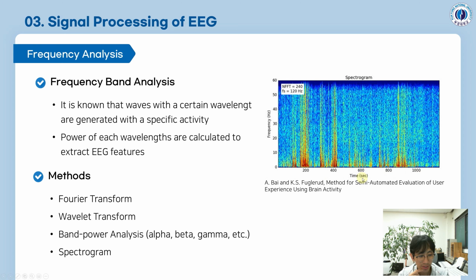Maybe this is seconds, I'm not sure. If this is seconds, then this is going to be 10 minutes from the start. Okay. So this is a very easy approach to understand the EEG. Because of the easiness of this way of analysis, this method, frequency analysis, has been popular for a very long time.